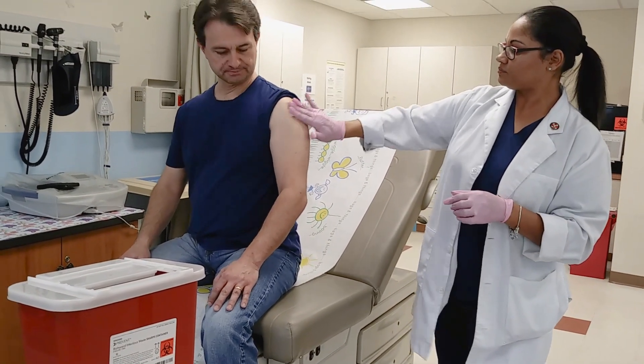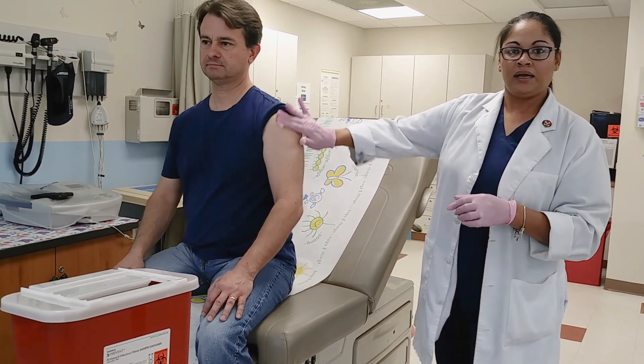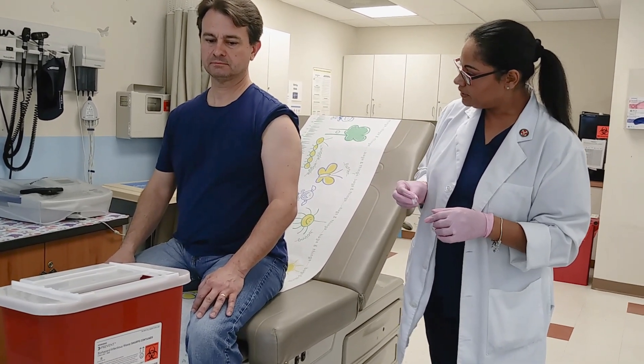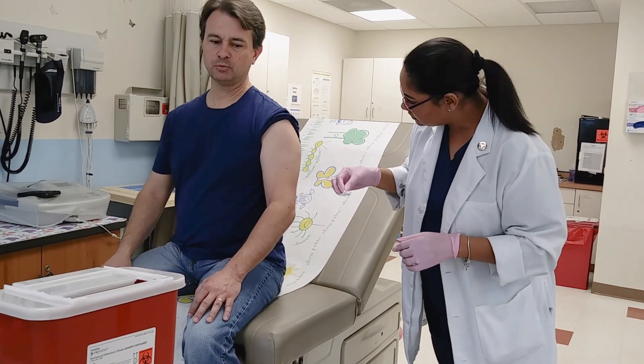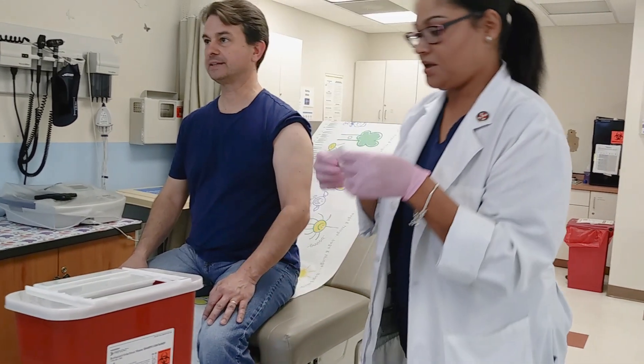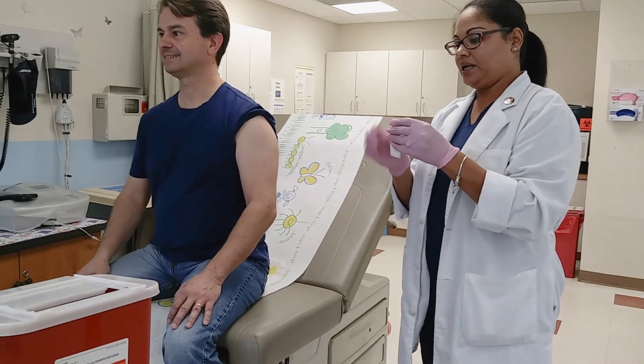How was that? Awesome — didn't even feel it. If we need a Band-Aid, you can ask the patient if they'd like one. I don't see any bleeding. Would you like a Band-Aid, sir? He wants a Band-Aid. I don't have any Superman ones, but I do have regular Band-Aids.